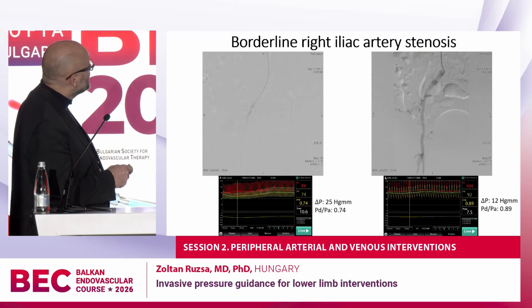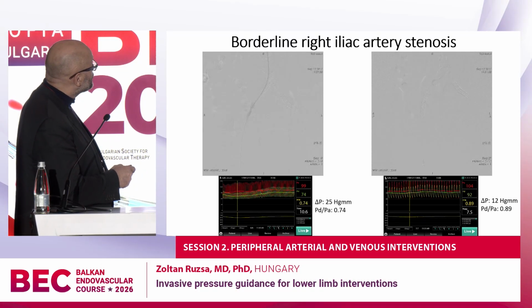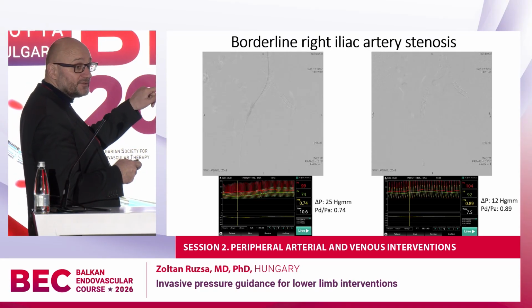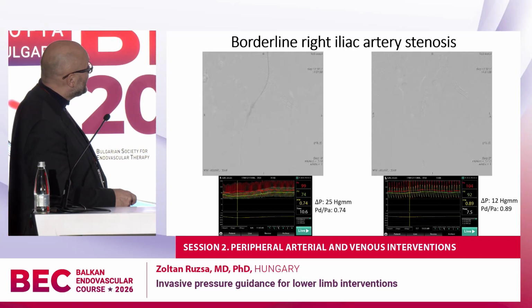So this was the lesion in the right iliac, which was... Can you push this? It's not working.